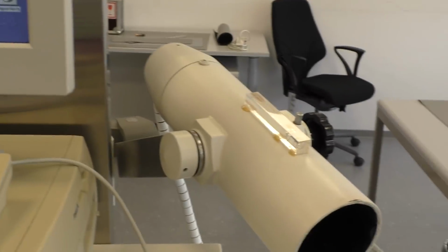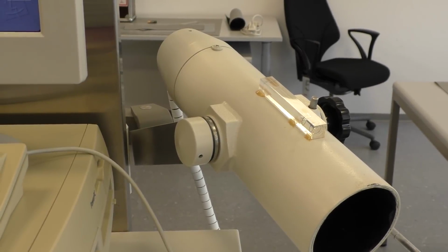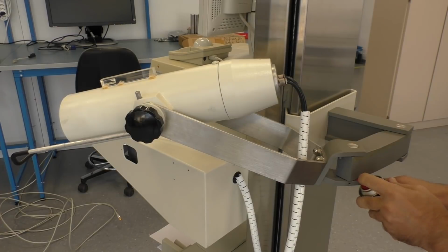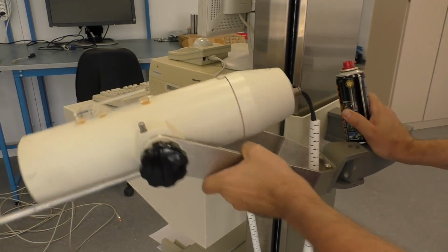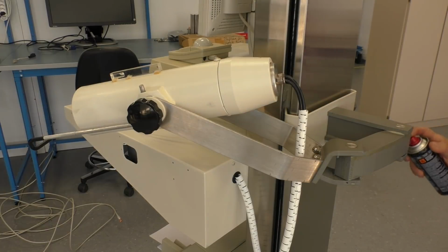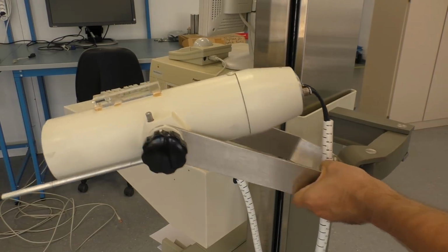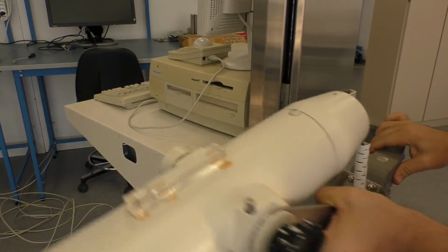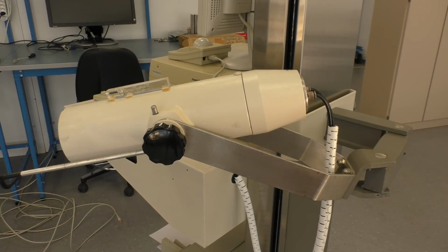So, let's have a look at the tube. That's something you're all waiting for. Let me shut down the system and then we will take that thing apart. Well, I noticed that the joints here are really going heavy, so I try to lubricate them a bit. Maybe that helps. Yeah, a little bit. Okay, but that's not the most important.